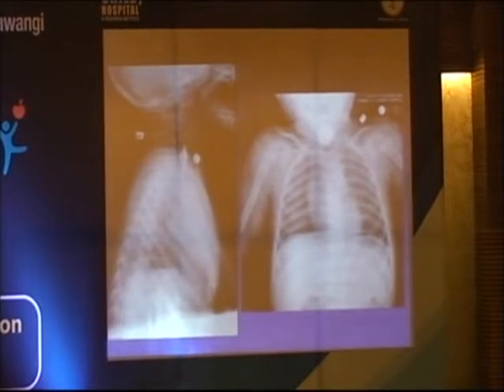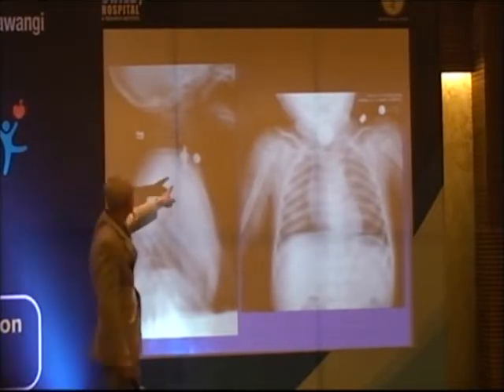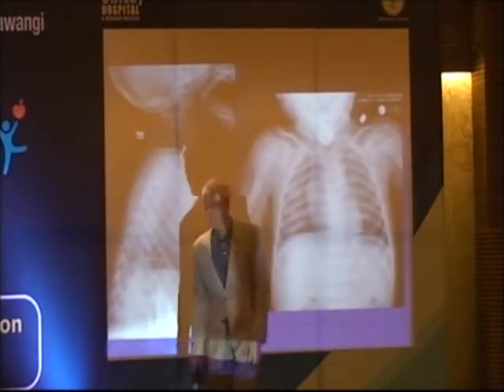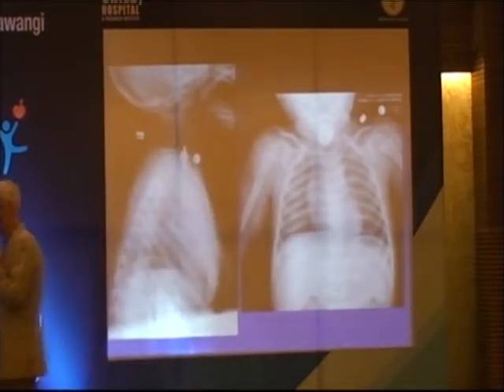How many of you think this is a foreign body? I've given you all the clues, inspiratory and expiratory stridor. And then what do we see here? Is there something in the upper airway? Yeah, there's something in the upper airway. And it doesn't matter whether it's really in the airway itself. We recently had a child that had a grape in the esophagus, and that compressed the membrane. So yeah, this child aspirated a watch battery.